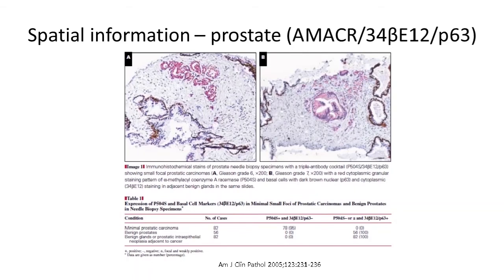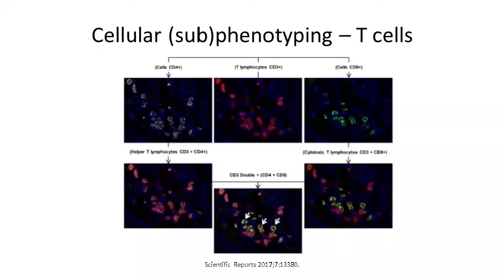So in this particular biopsy, you can see that there's just a small glandular structure which may be only present in one particular section. So if you do another section, that may be actually cut out of this tissue. So it would be very useful to actually do this particular multiplex stain on that single section to determine that this is in fact an invasive glandular structure, as opposed to the ones which are close to it, which have this intact basal epithelial layer.